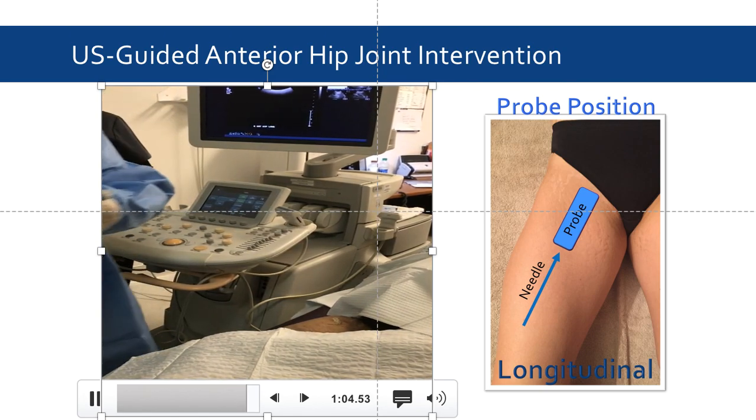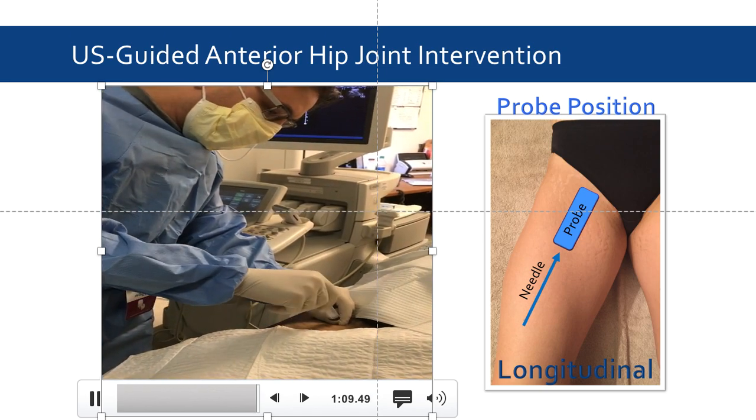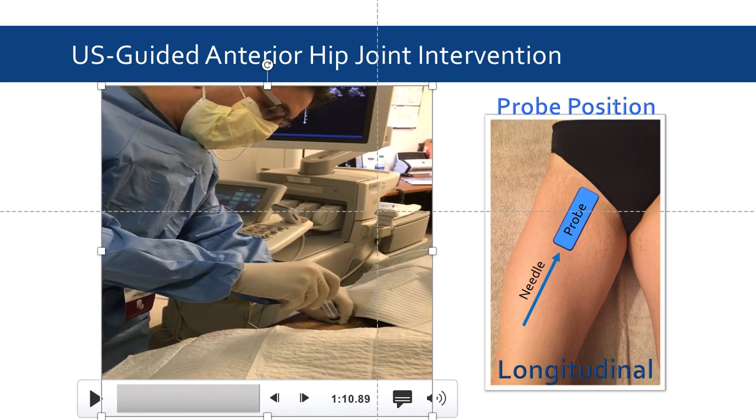Using just a regular 10 cc syringe. Following the attachment of the syringe, we can aspirate the fluid and complete the arthrocentesis.